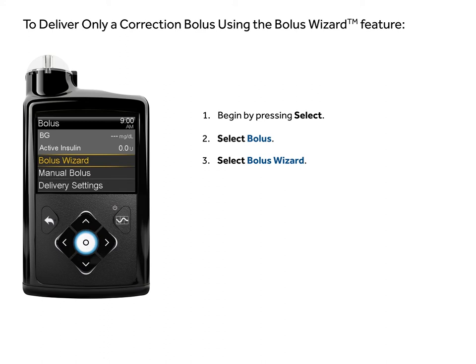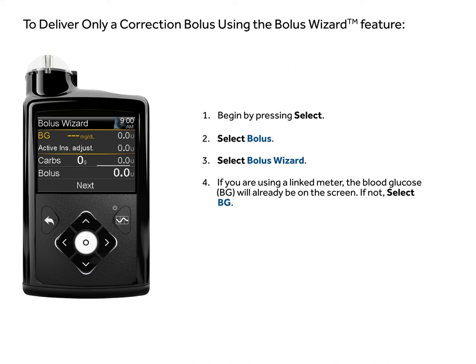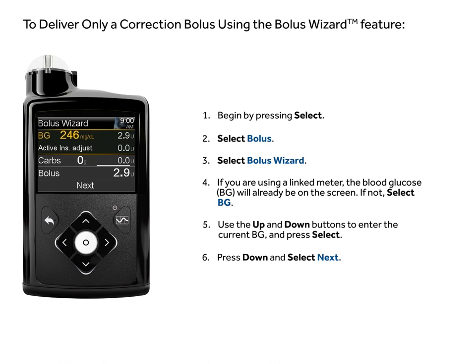If you are using a linked meter, the blood glucose BG will already be on the screen. If not, select BG. Use the up and down buttons to enter the current BG and press select.